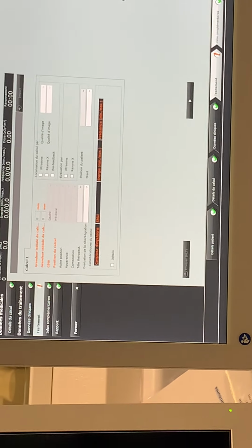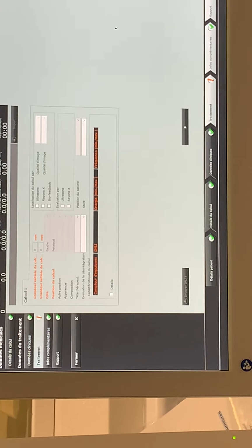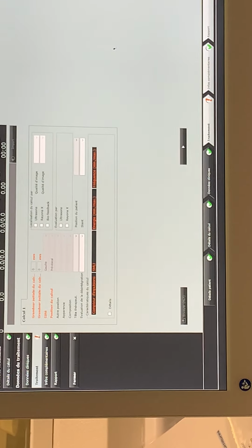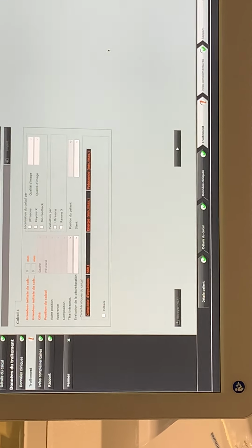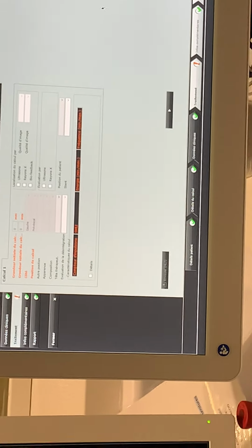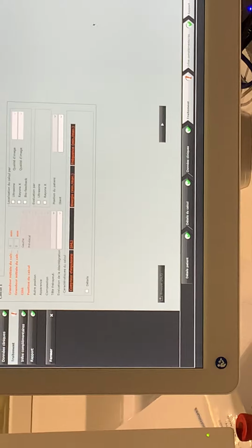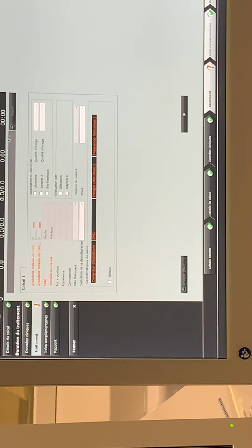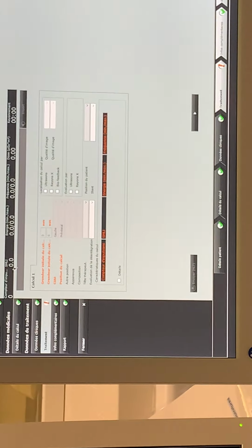If you go to the next chart, there is a big orange arrow, which means there are data missing. These data our system will get after we finish the treatment, because these are the treatment data: shockwave, energy level. It will be entered automatically with one mouse click. The size you need to enter, but all of this information, like how many shocks and so on, comes in automatically.